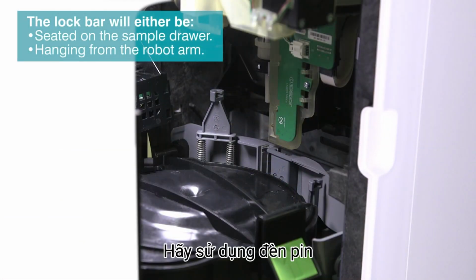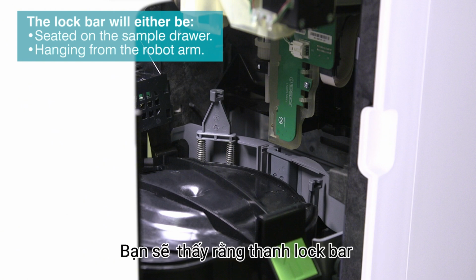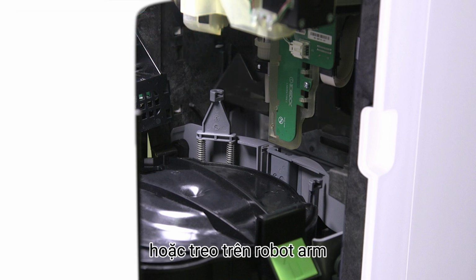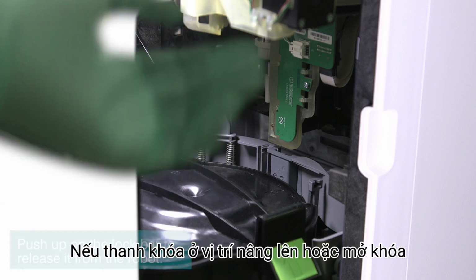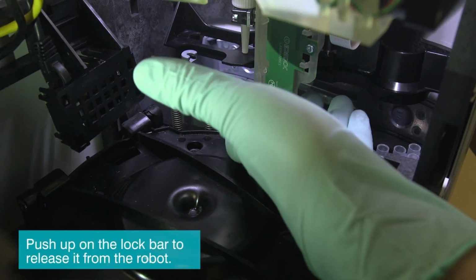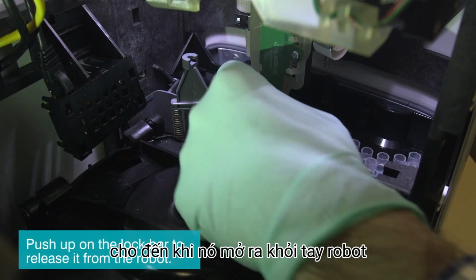Using a flashlight, look at the area above the sample drawer. You'll notice that the lock bar is either seated on the sample drawer in the locked position or is hanging from the robot arm. If the lock bar is in the raised or unlocked position, you'll need to release it. To do so, push up on the lock bar until it unlatches from the robot arm.